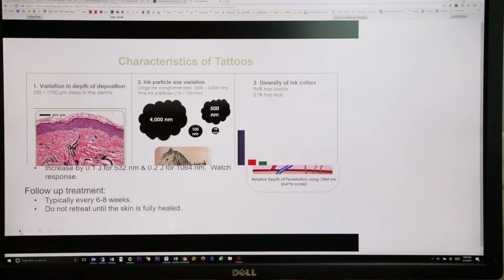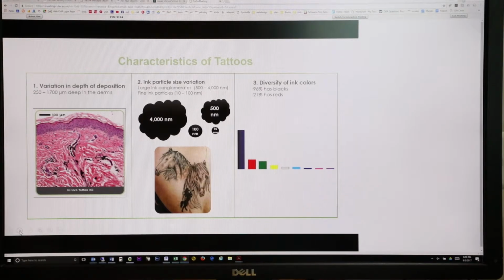So as I was saying, we don't like to promise complete resolution because everybody's tattoo is different. The hardest tattoos are when they don't tell you that they have 2 or 3 tattoos on top of one. So those correctional tattoos, those non-professional tattoos, those tattoos where their tattoo artist was a little heavy-handed.